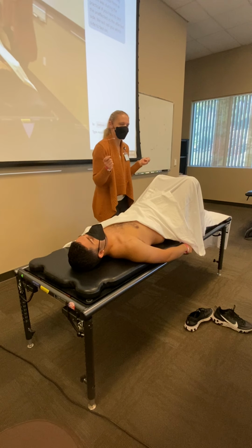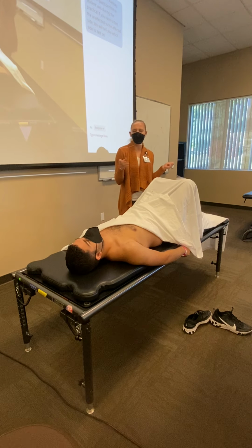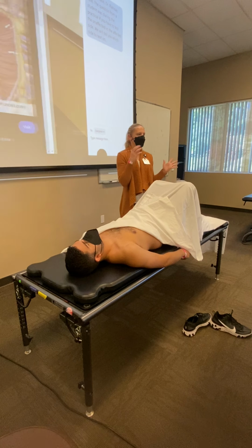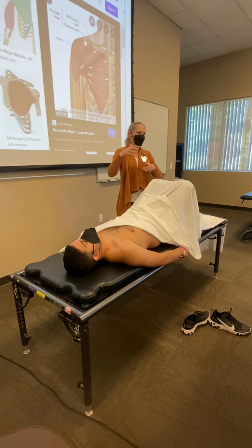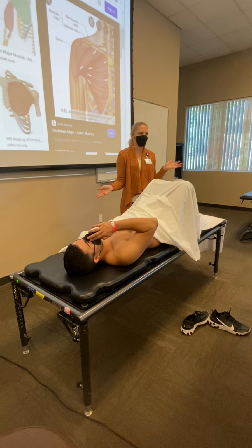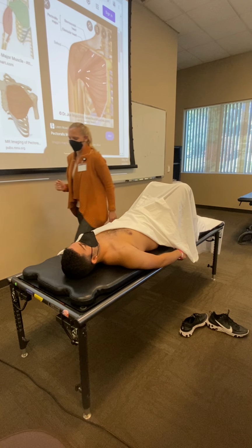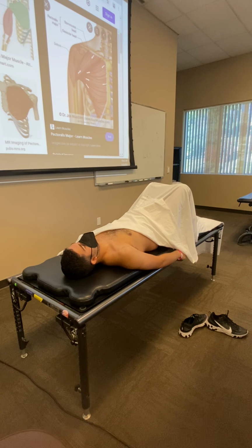Yes. So if you pull pec major, I can't remember if we ask you specifically clavicular or sternal fibers, but if we don't ask you specifically, expect to do both fibers. Good? I need to grab my goni, excuse me.